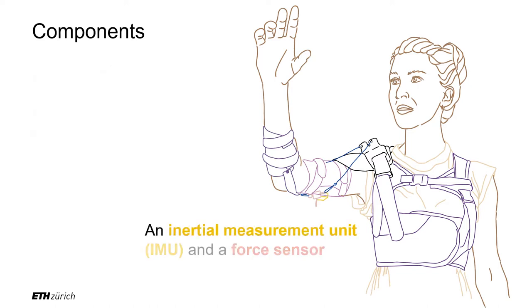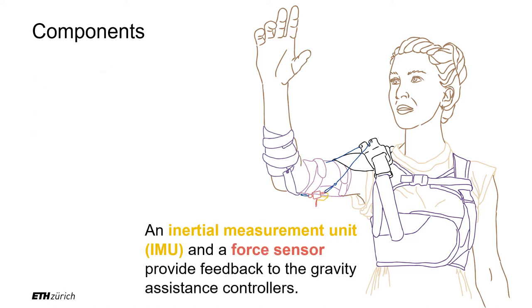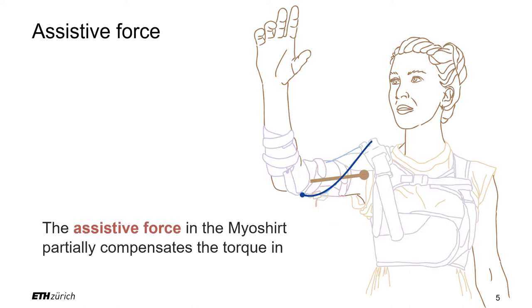An inertial measurement unit and a force sensor provide feedback to the gravity assistance controllers. The assistive force in the Myoshirt partially compensates the torque in the shoulder induced by gravity.